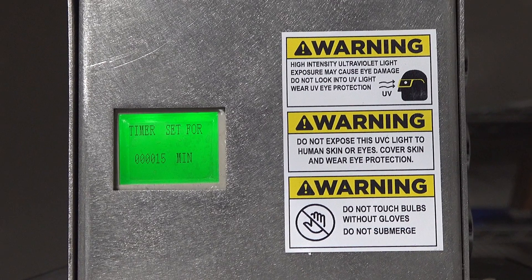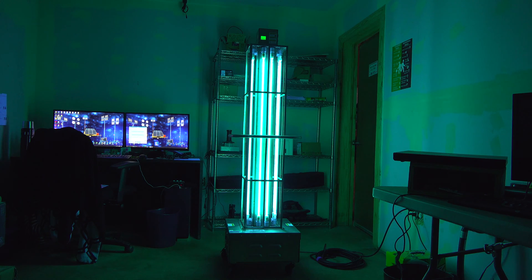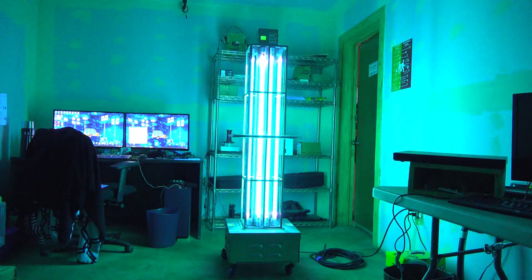The carts in this series offer a full 360 degrees of coverage, making them the most efficient UV carts on the market today.